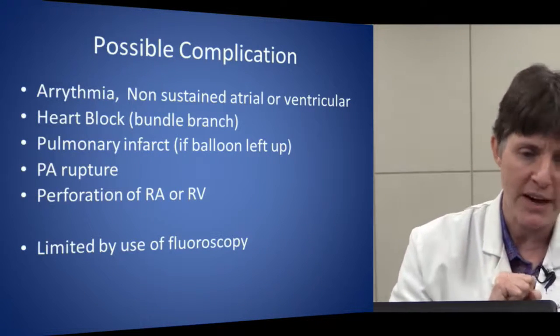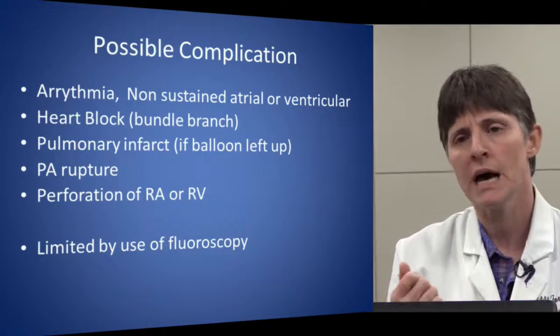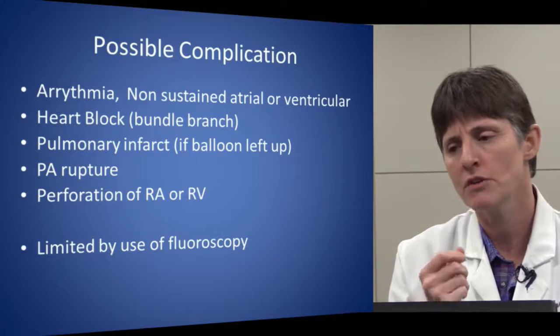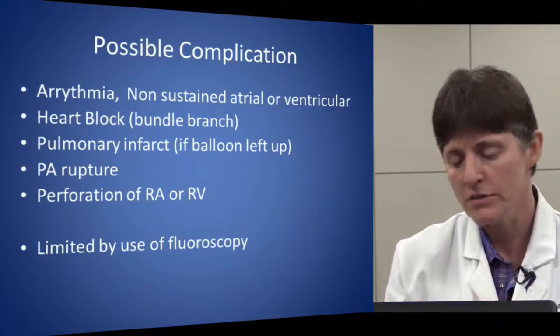If somebody has devices in their heart, i.e. a pacemaker or an ICD, you can't blindly float in there because you need to make sure your catheter's not hooking up on their pacer wires and you're not dislodging them.